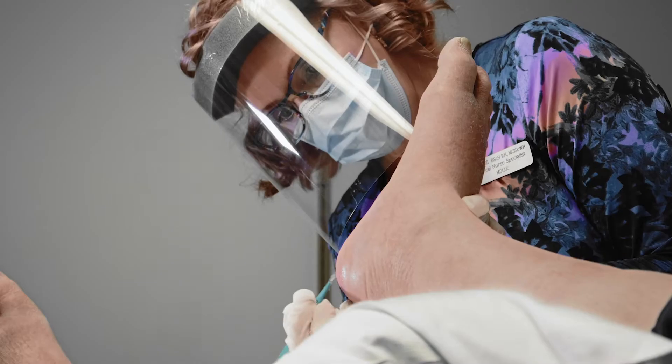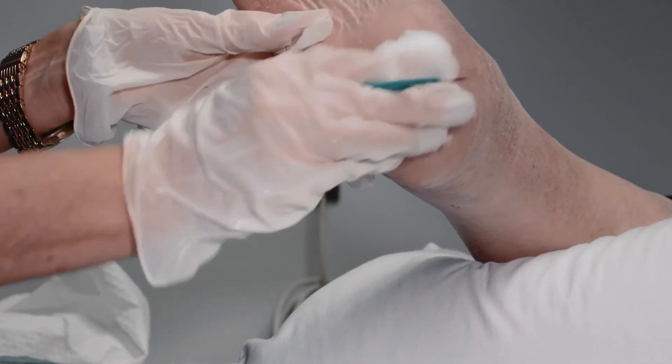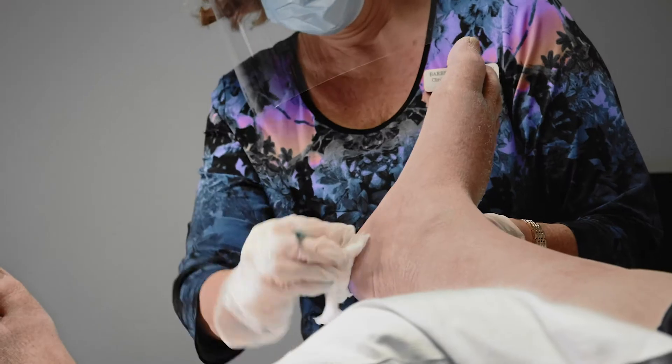Debride the wound area to deliberately expose a bleeding base. This ensures that Dermagen is in contact with healthy granulation tissue in order to promote wound bed adhesion, early incorporation, and new tissue growth.